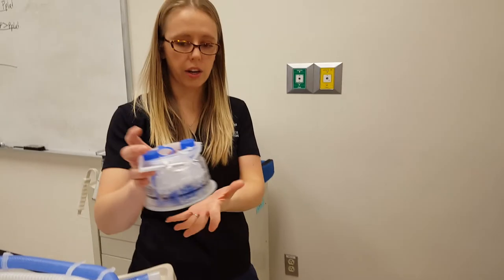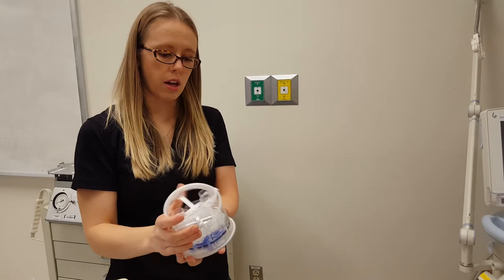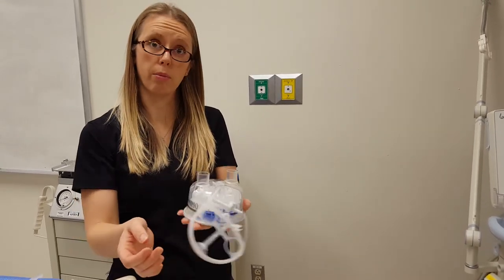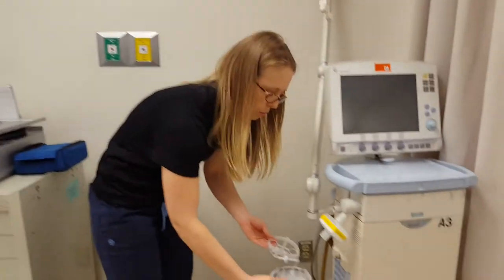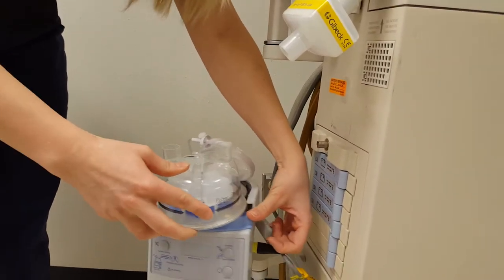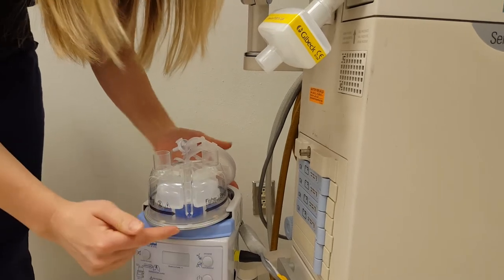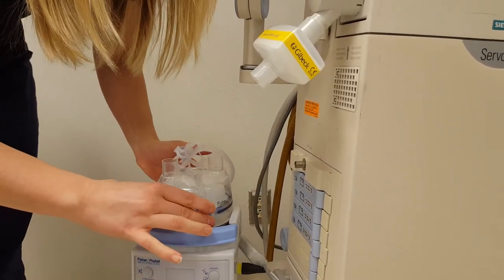Take your heater basin and open it up. The blue part is just trash — you won't need that. The remaining piece is what you'll use to hook to the water bag to make humidification. Pull that off and let it hang. The basin goes onto the heater: push the little button, slide it back, and make sure the silver edge is under the edges of the heater until it clicks in.